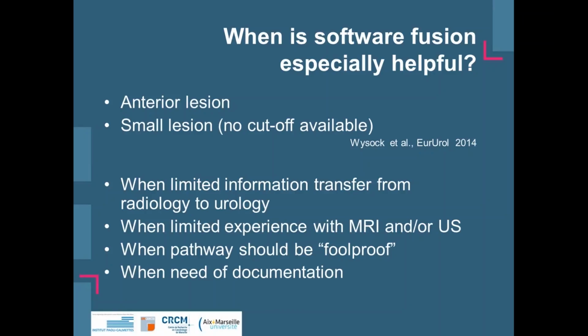For example, if you do not have the possibility to sit down with your radiologist and have a look at the pictures together. In such a case, the radiologist could send you the marked pictures in a DICOM format, which could then be integrated into the fusion system, and that might help to render the entire clinical pathway more feasible. It is with this also useful if you have limited experience with MR reading as well as ultrasound imaging.